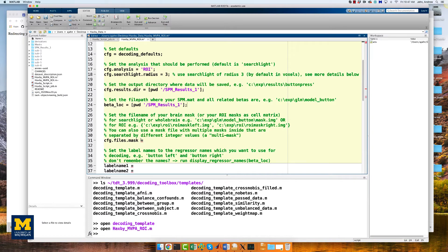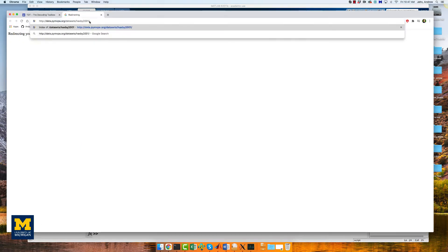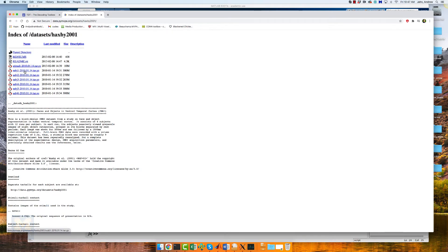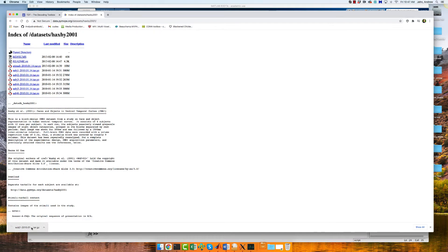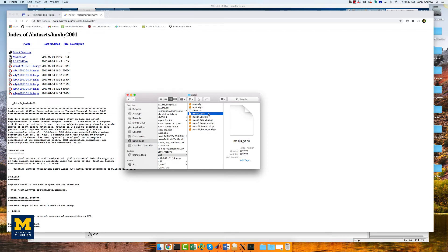On line 31, we will set a path to the mask. The book chapter explains how to create the mask using the methods in the original Haxby paper, but we can instead download the masks themselves from the provided website in the More Info box below. Click on the file Sub_1_2010-01.14, which will download the original functional and timing data for Subject 1 as well as the mask used in the original paper. When it downloads, click on it to unzip and unarchive it. Double-click on mask4vt.nii.gz to unzip it — this is the ventral-temporal mask we'll use for the MVPA analysis.